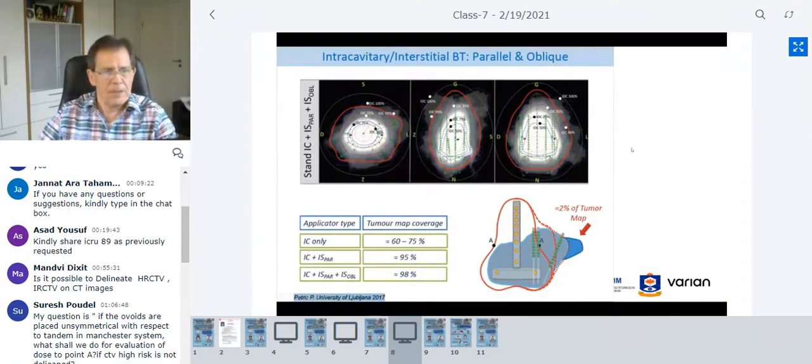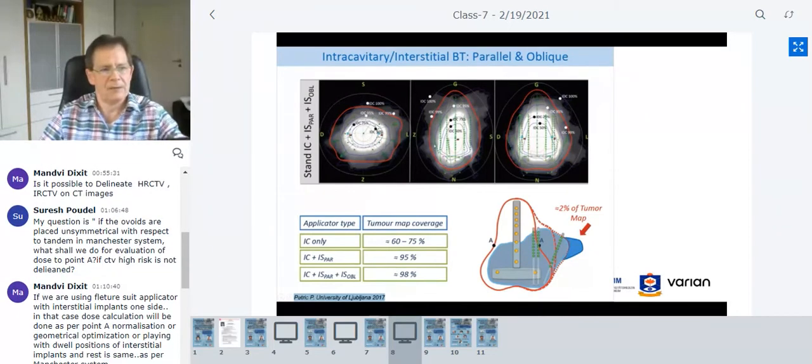Good. A very nice slide from Primož Petric, who is a doctor working now in Zurich. At the time when he was in Ljubljana, he pooled his patient target volumes. So I think these are about 250 patients. He just overlaid all target volumes and got a kind of map here. So the grayscale, or the intensity of the color, indicates the, let's say, likelihood of the target area.